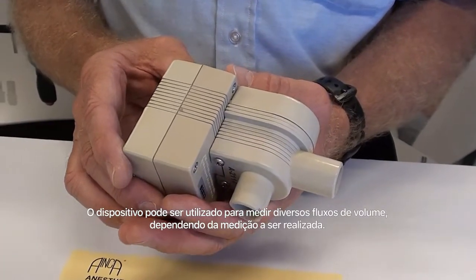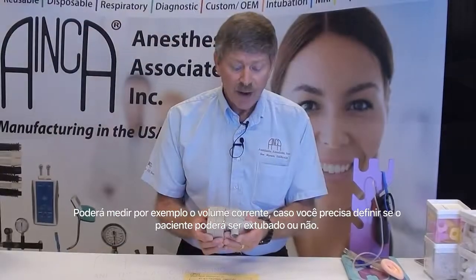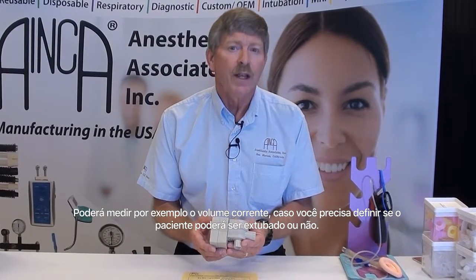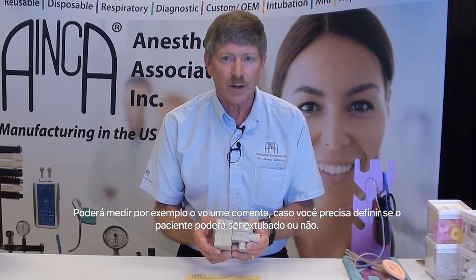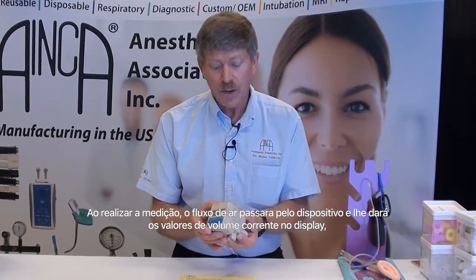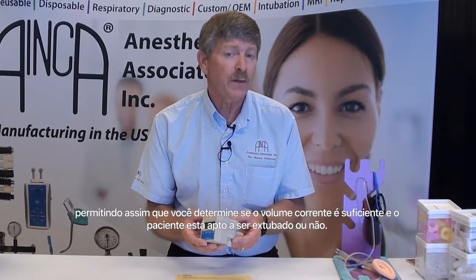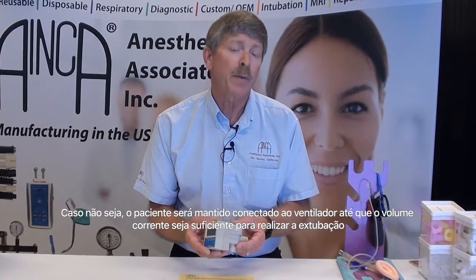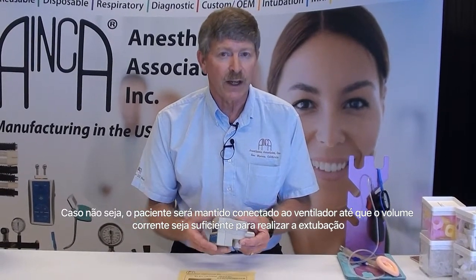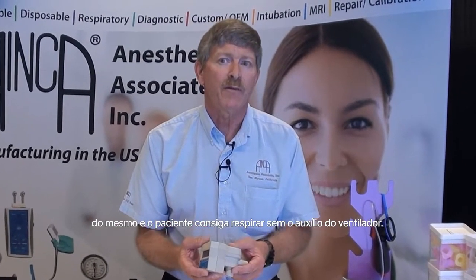The device can be used to measure various flow volumes depending on the utilization necessary for your case. For example, it can be used to measure tidal volume if you are looking to determine whether a patient should be extubated. As the gas flows through the device, you'll be able to measure the output on the display and determine whether a tidal volume breath is sufficient to consider extubation. If it's not, the patient will often be reattached to the ventilator and ventilation will continue automatically until the patient is able to breathe sufficient tidal volume without ventilator assist.